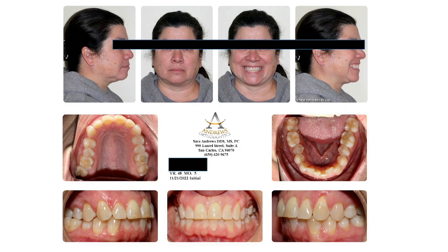That's the first thing I would have done. Put a palatal expander, get the first molars out of crossbite. So the reason Invisalign worked, her concern is the lower crowding, right? But am I going to tell her, oh, I'm going to fix that and leave your crossbite the way it is? Absolutely not. Because I'm going to go all or none. Because I know I can fix that crossbite.